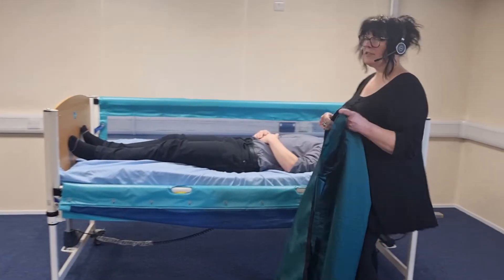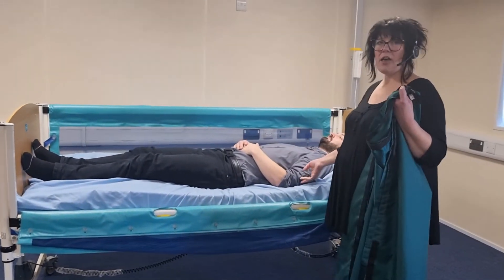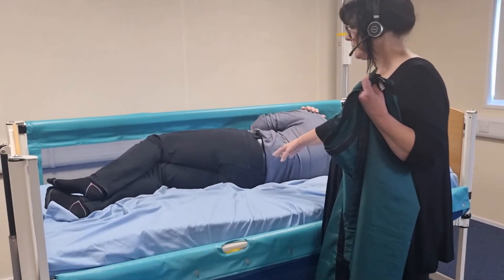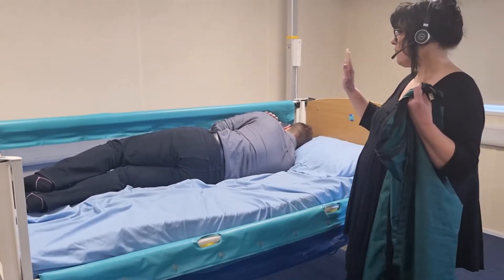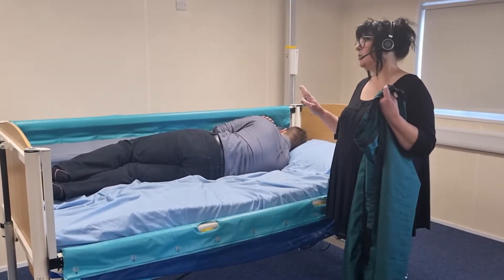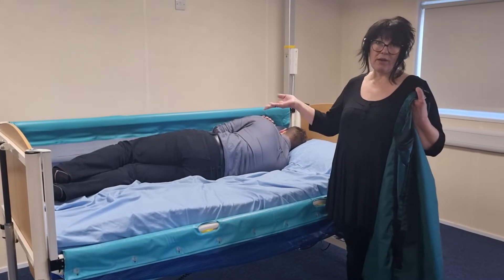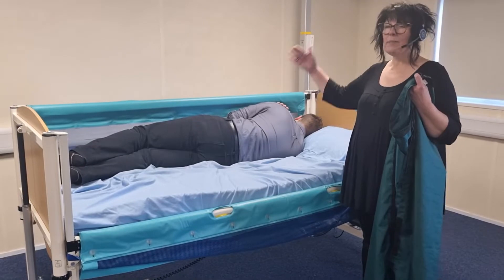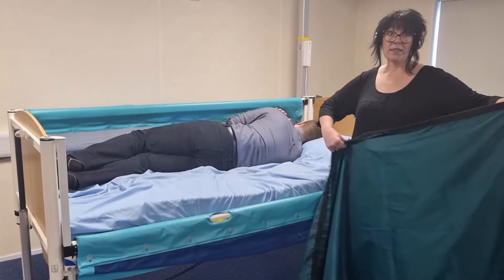First of all, we ask or assist our person to roll onto their side. We never roll towards an unsecured side of the bed — either use bedside rails like we have done here, or in a community setting the bed might be against a wall, or you might roll the person towards the handler.